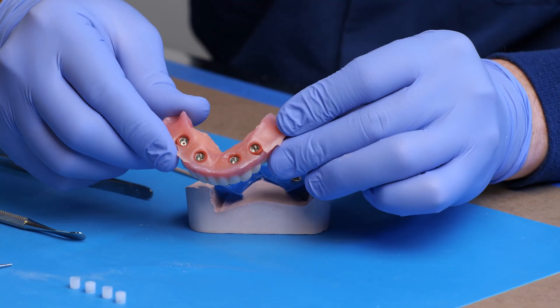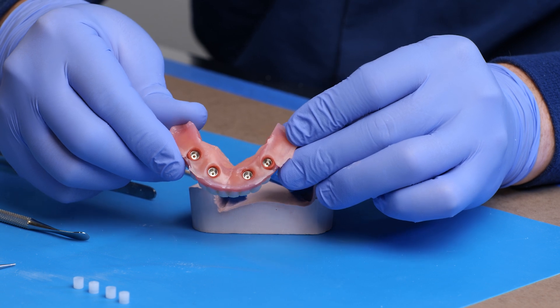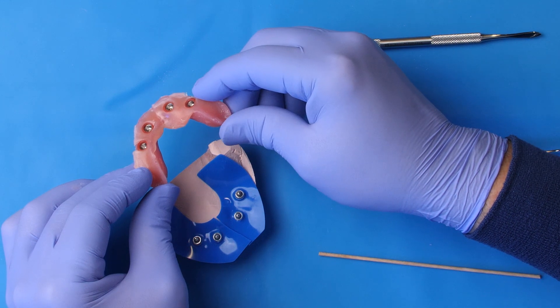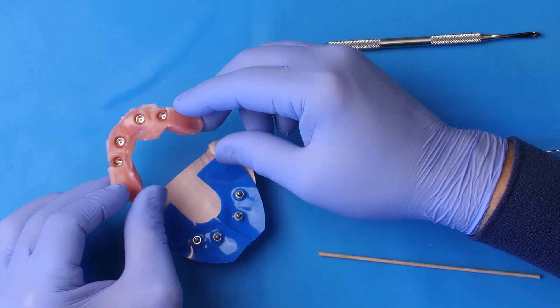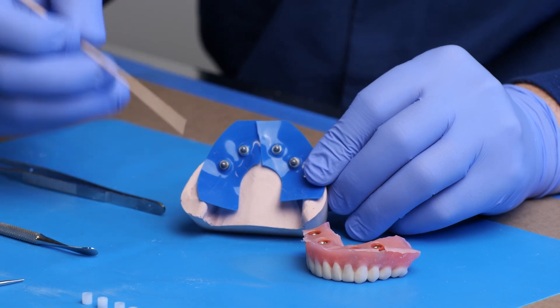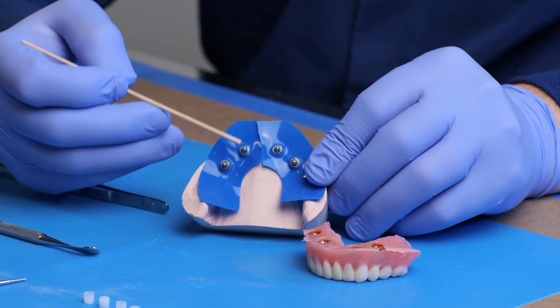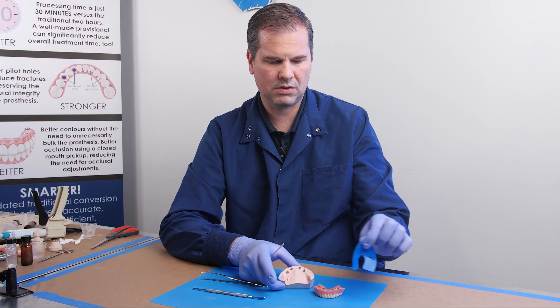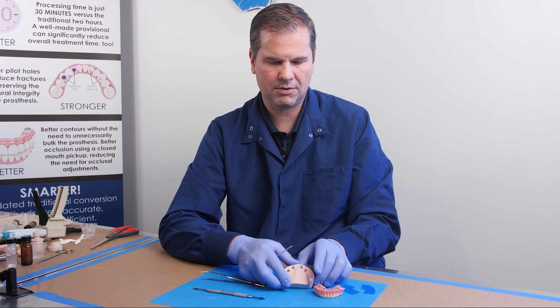You can see here that we've captured all of those tie bases, including the silicone O-rings, and that's actually a good thing. Now we've got the separable fasteners still stuck in those multi-unit abutments, so we're going to go ahead and remove the rest of this silicone dam and set it to the side — that's trash now.